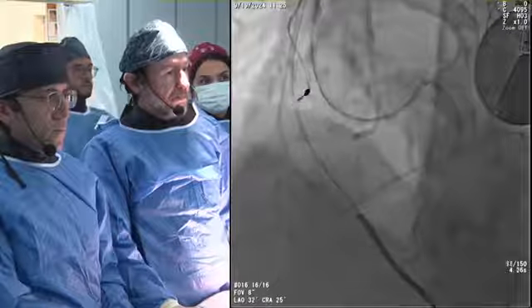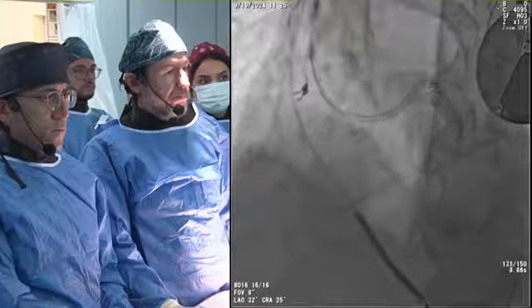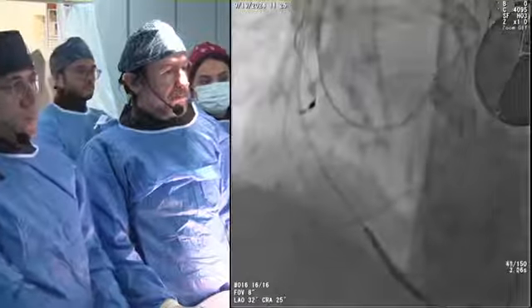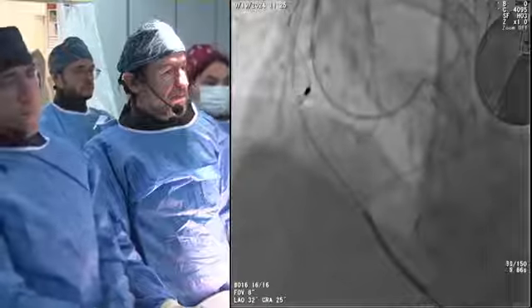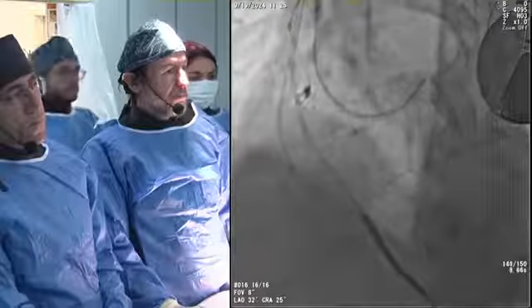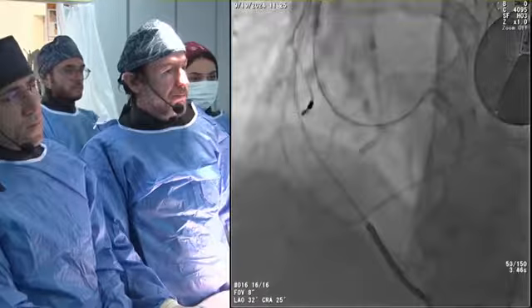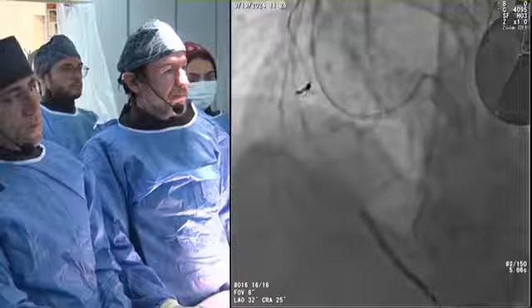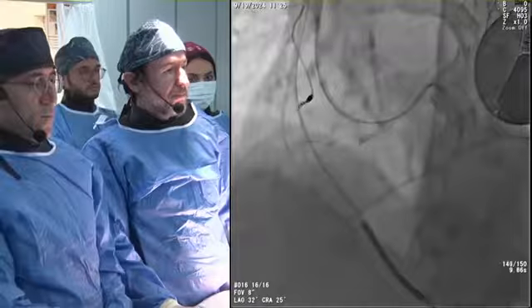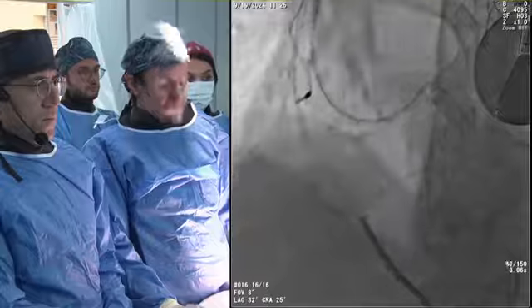But if there is no other way possible, we probably have knowledge of the E-CART, electrocautery, re-entry. Today we have a specialist for E-CART, Dr. Ashwad here. So probably we have all sorts of technical advice. But if there is one advice just for me, probably I would have changed the antegrade system to the femoral, because the radial stabilization is not good.